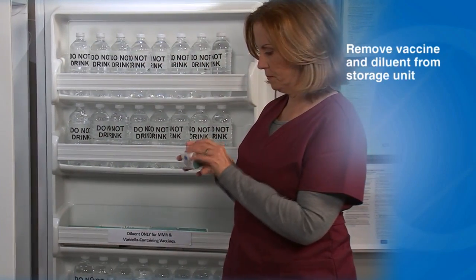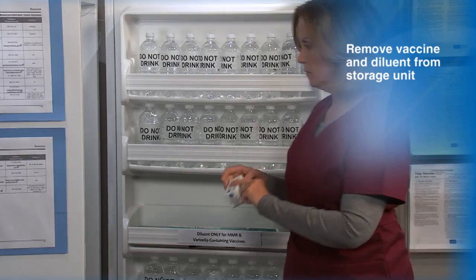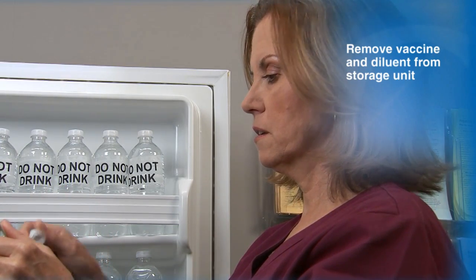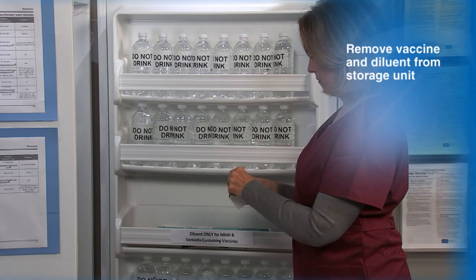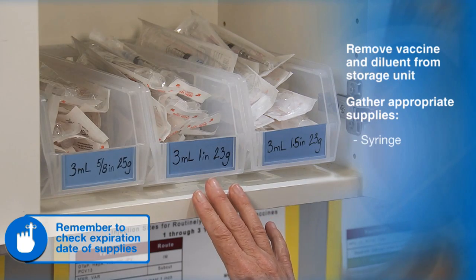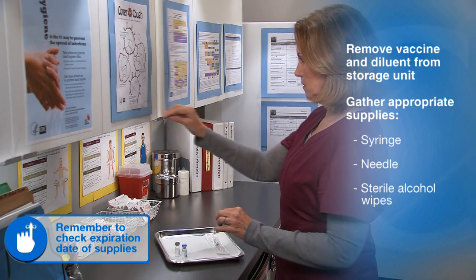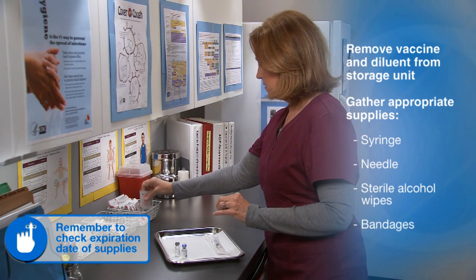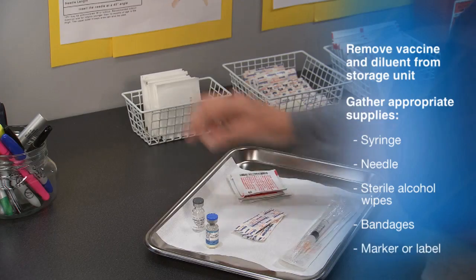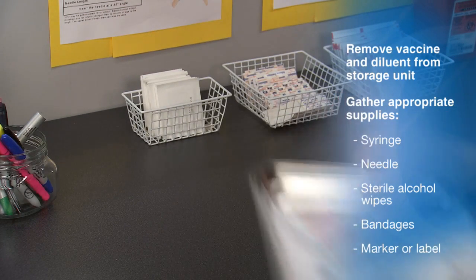Begin by removing the vaccine and diluent from the storage unit. Next, gather the appropriate supplies, including syringe with needle, prepackaged sterile alcohol wipes, and bandages. Needles and syringes may be packaged together or separately. A marker or label will be needed to identify the reconstituted vaccine once it is in the syringe.